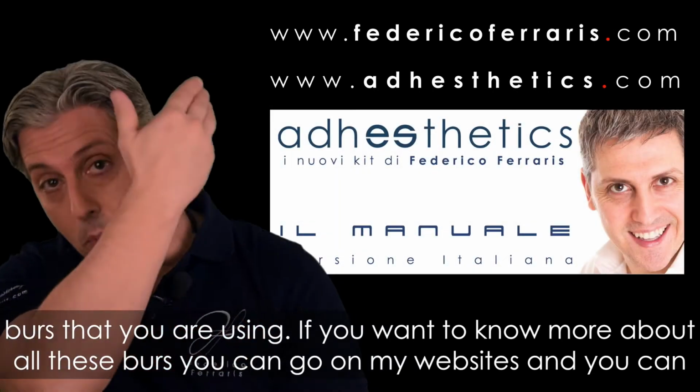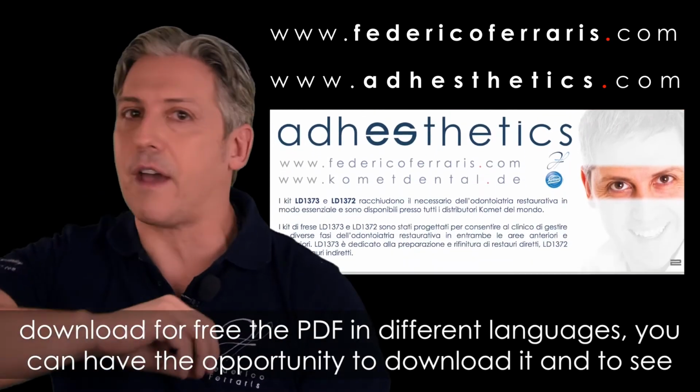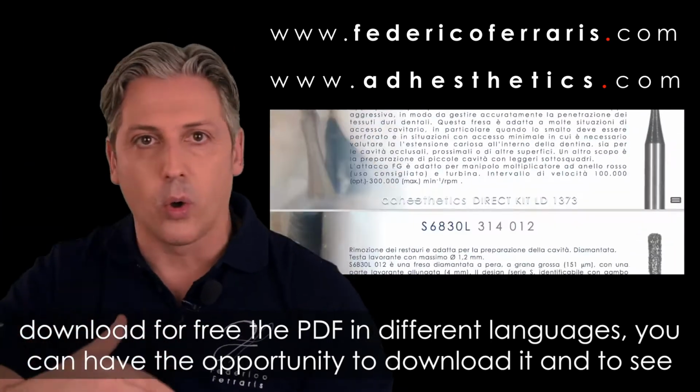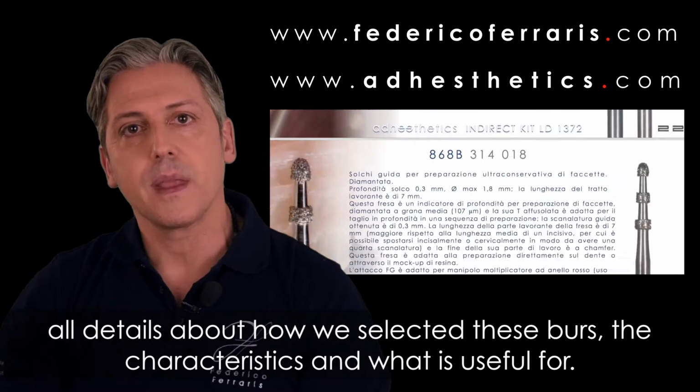If you want to know more about all these burrs, you can go on my websites and download for free the PDF in different languages. You can see all details about how we select these burrs, the characteristics, and what they are useful for.